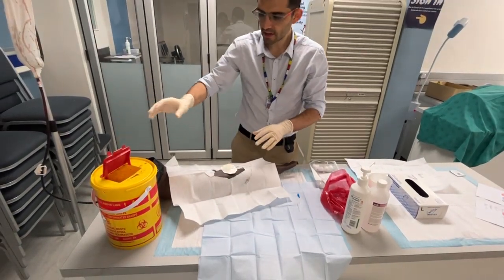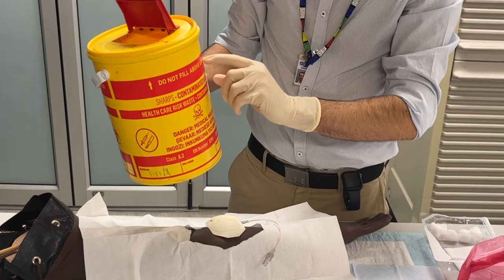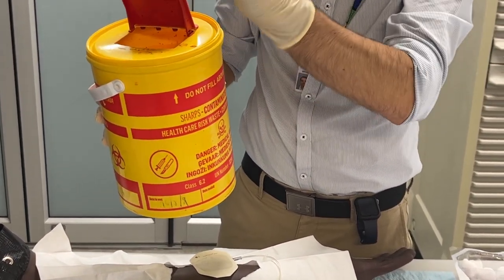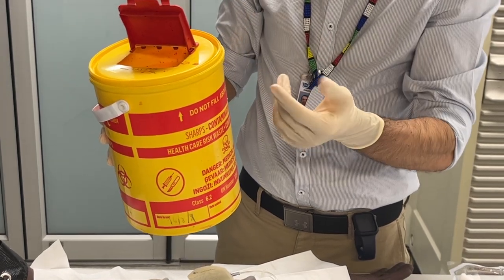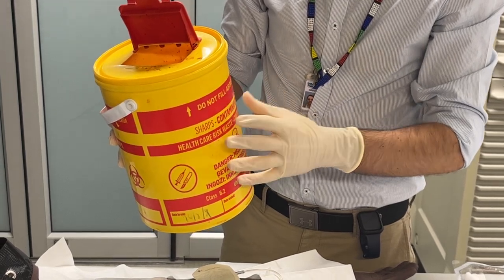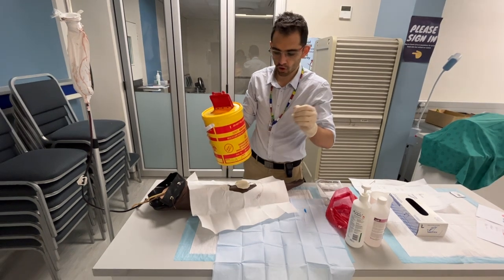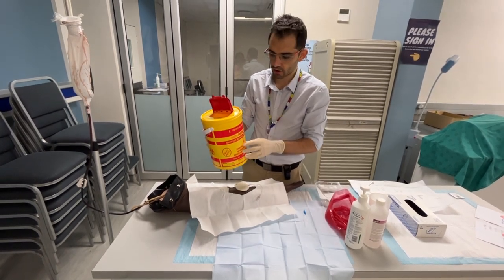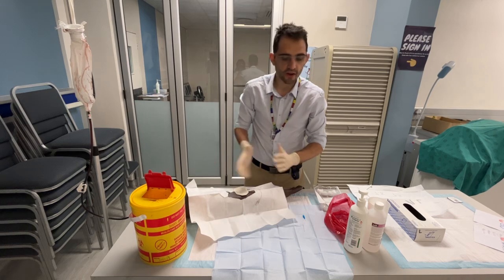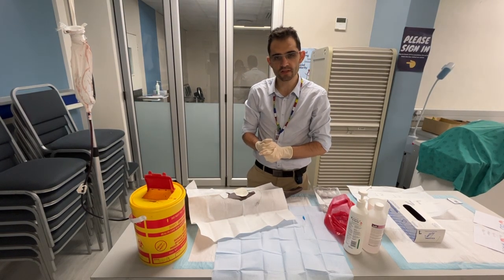Importantly, keep in mind that your sharps container has a 'do not fill above' line, so please make sure your needles and syringes are not above that level, because if things are poking out there's a risk you'll prick yourself. If that is the case, go to the person in charge of the ward and ask for a clean one. Make sure it is directly next to you so you don't have to walk around the ward with a needle — just directly throw it into the sharps container. Obviously clean up, thank your patient, do your hand hygiene again, and that's how you prevent a needle stick injury. Thank you.